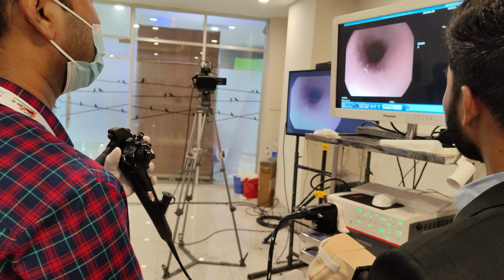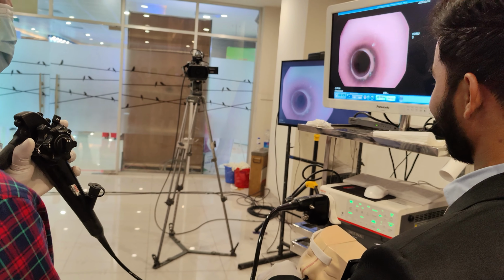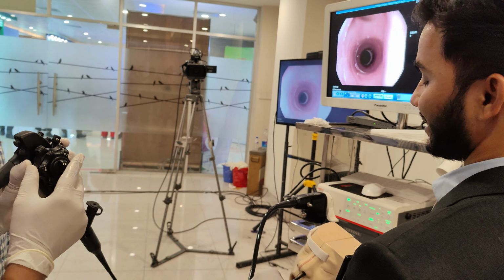Biopsy can be taken from any suspicious lesion. Also, foreign body can be removed with the help of foreign body forceps.